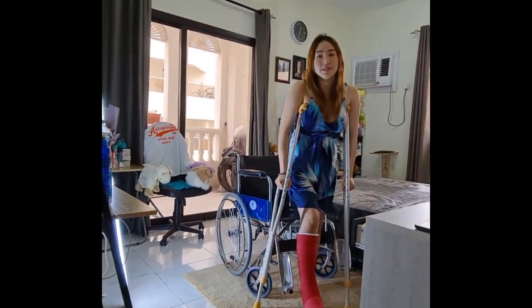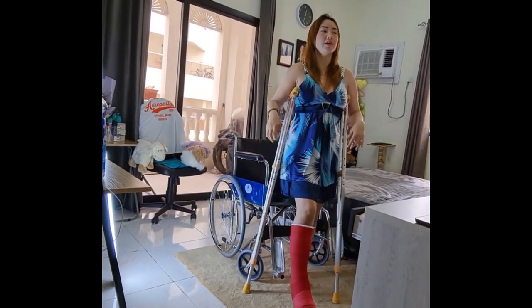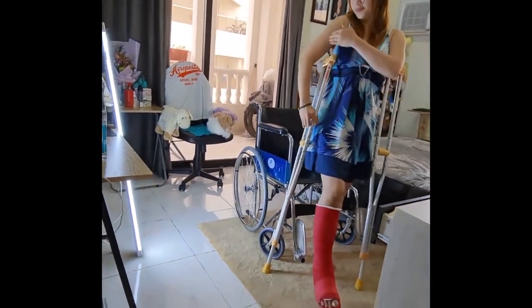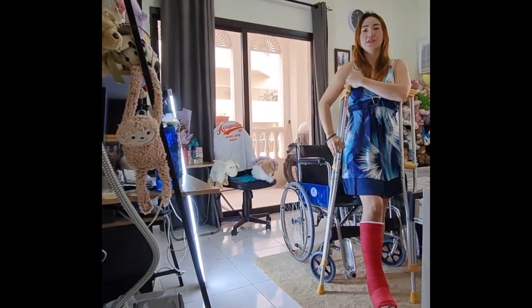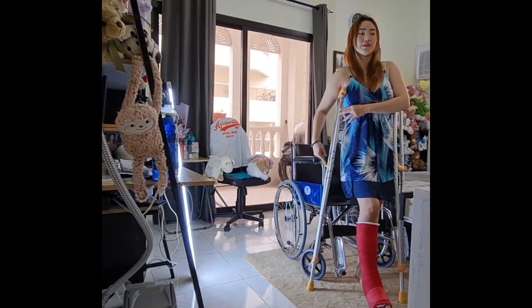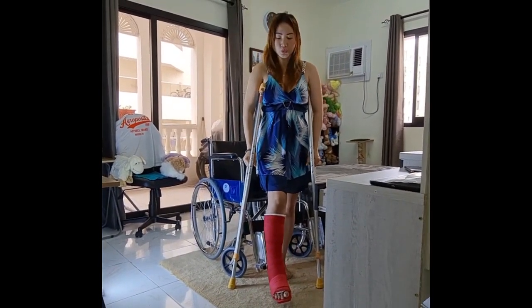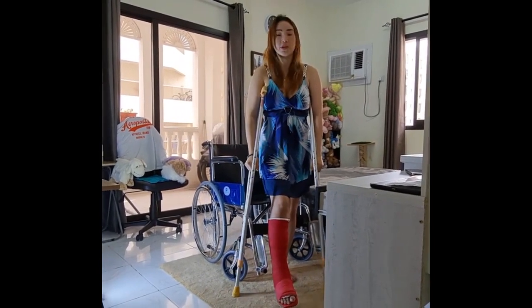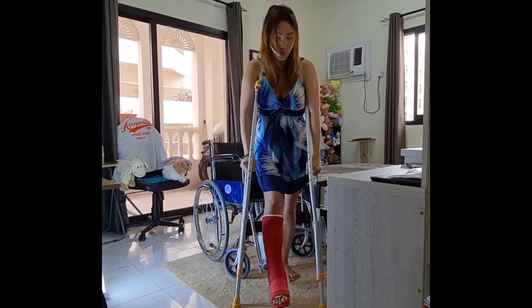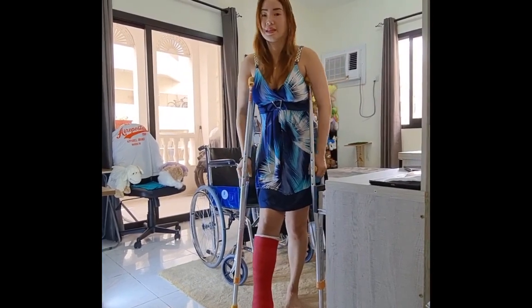Don't place the crutch directly in your armpit because you have nerves there and it will affect them. The gap should be two to three inches — not too tight and not too much space. The handgrip should be at your wrist level. When walking, the crutches and the weaker side move together first, followed by the stronger side. Hop forward and put all your weight through the handgrip area.